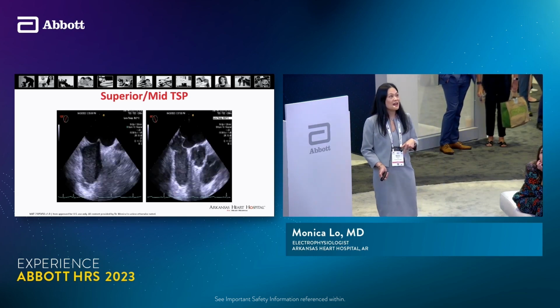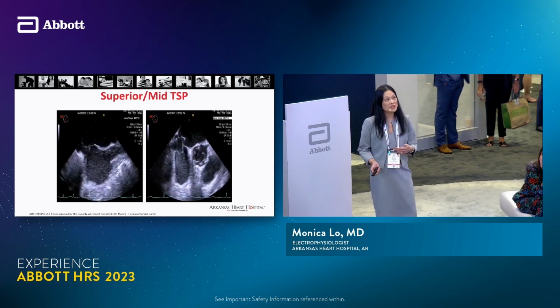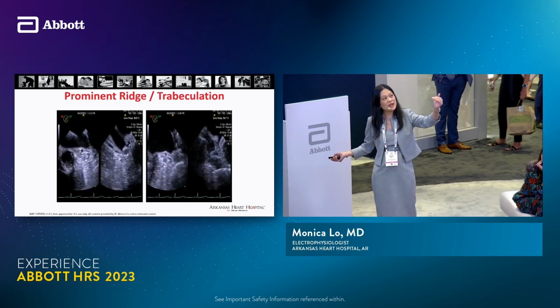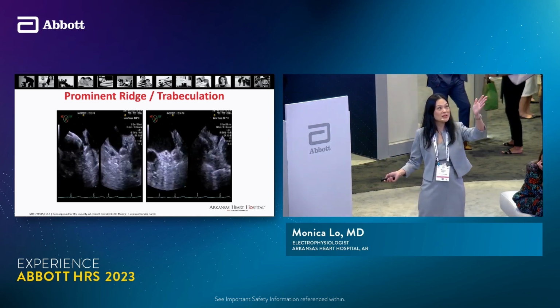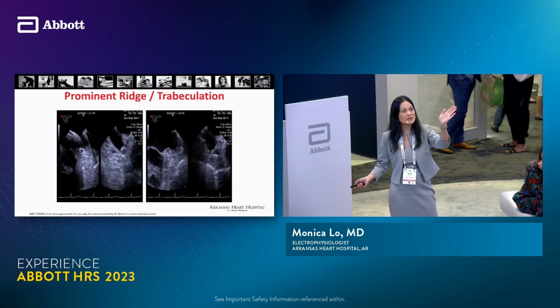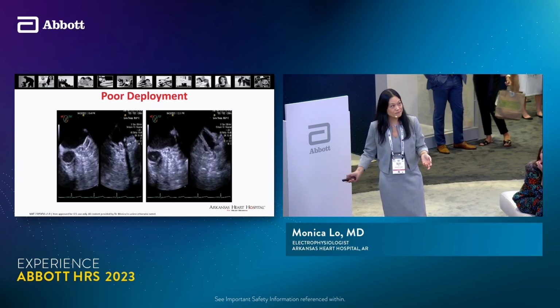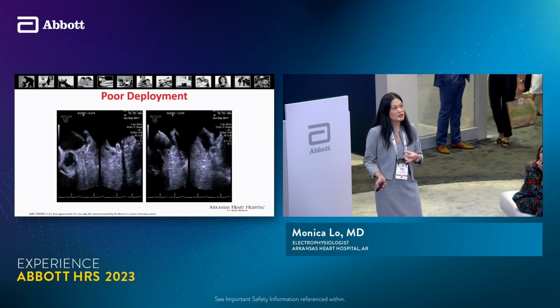So I actually took wherever the needle could go, which ended up being more superior mid in the transseptal puncture, and then initially sweeping over, it looks like, okay, it may be somewhat coaxial into the left atrial appendage. However, if you can see the right side hand screen with a 135 view, you see that my sheath is hitting against that PV ridge and trying to push it, as well as all the trabeculation is trying to push it out. So the deployment is not good. You can see that the lobe is not 2/3 past the left circ.